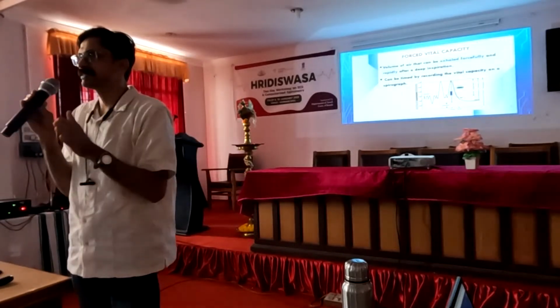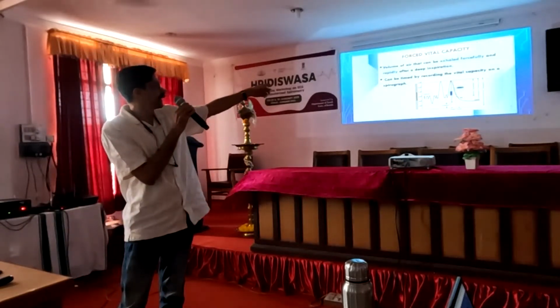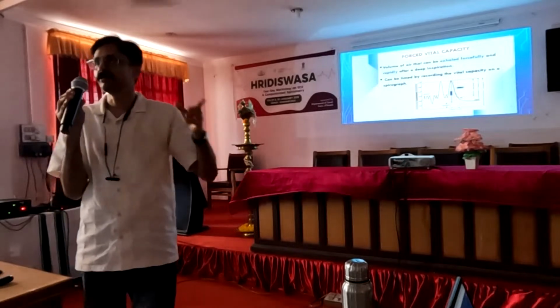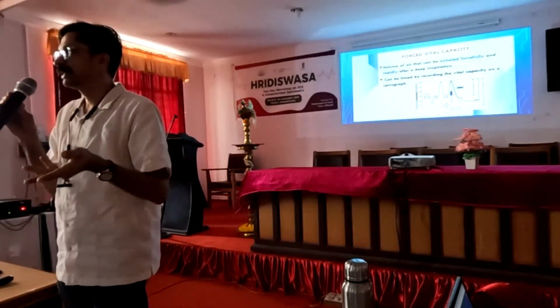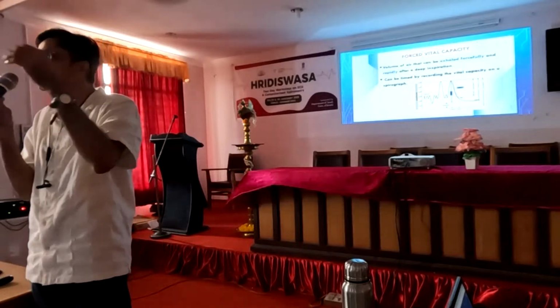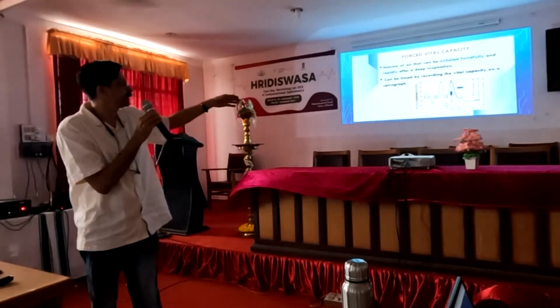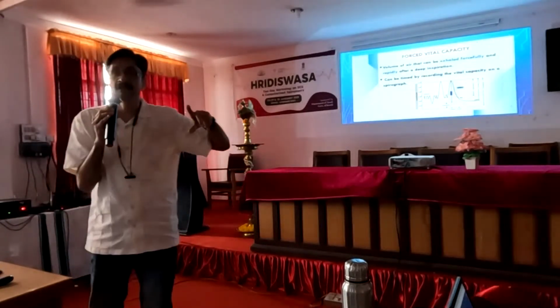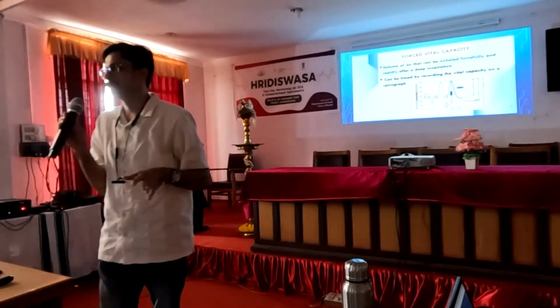Here, in forced vital capacity, it is exhaled forcefully and rapidly. The only difference is that in vital capacity they do it in their own time, but here we are assessing with time. We use a spirometer, and it can be timed by recording the vital capacity on a spirograph. So it is timed vital capacity or forced vital capacity.